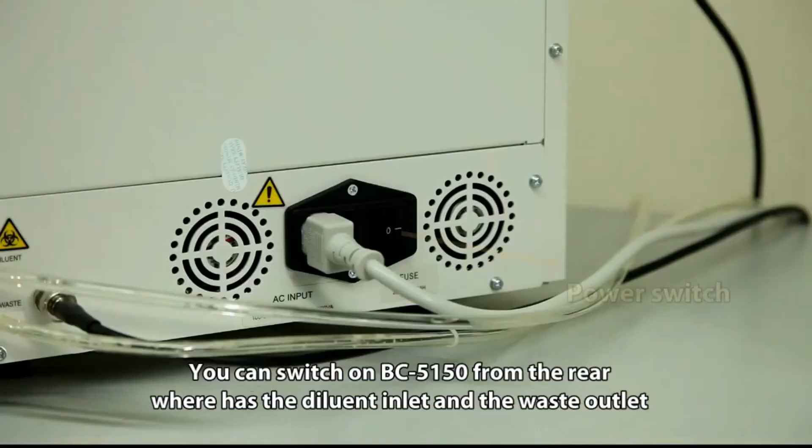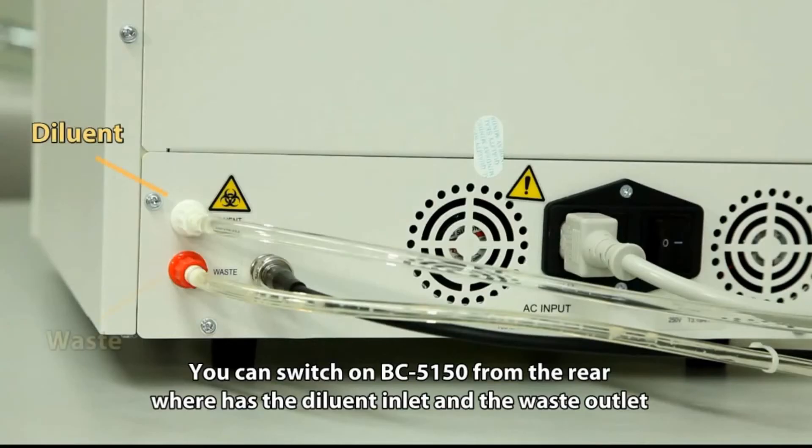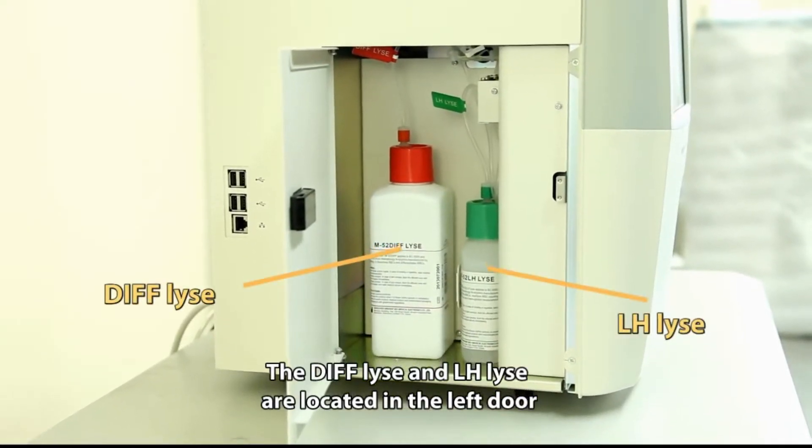You can switch on BC5150 from the rear, where there is a diluent inlet and a waste outlet. The waste sensor monitors the liquid level and gives an alarm before the waste is full. The DIFF lyse and LH lyse are located on the left door.